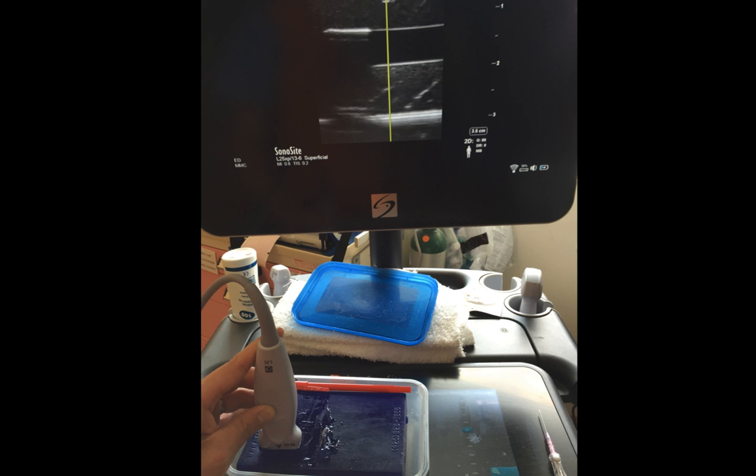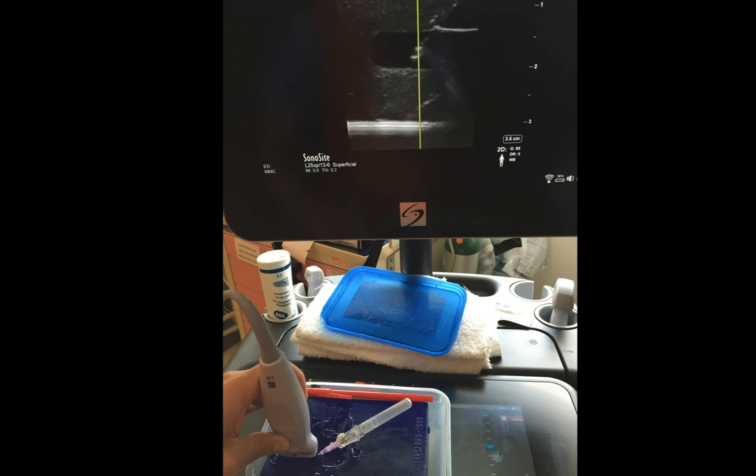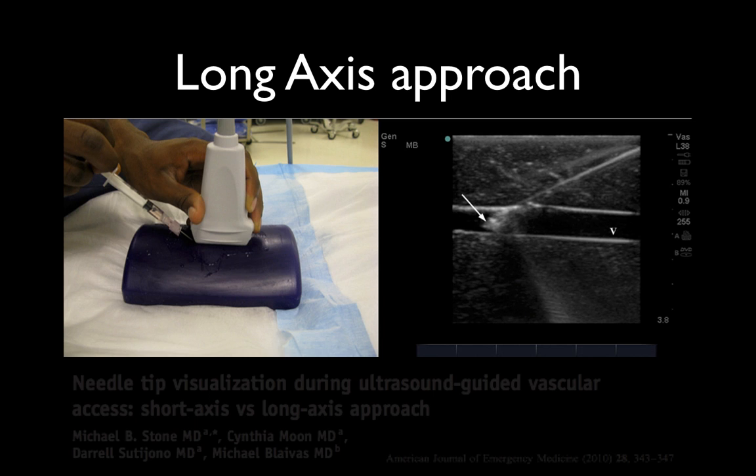Here we have the probe in long axis, and on screen you can see the vein also displayed in long axis. This is much more technically difficult to perform. However, the key advantage is that you can actually see the needle going in along the entire long-axis plane, confirming you've entered the vessel without going through-and-through. You can then watch the catheter advance into the vein. The challenge is that the plane the sonographer can pick up is only about a credit-card thin, so you must know exactly where the needle is. Center on the vein to avoid getting a cross-section.